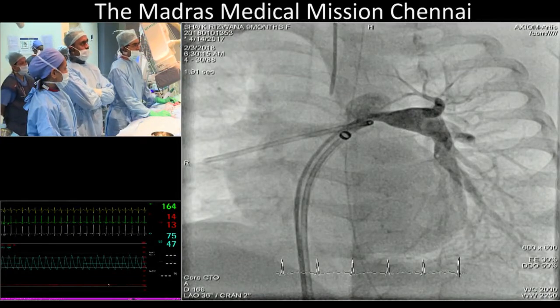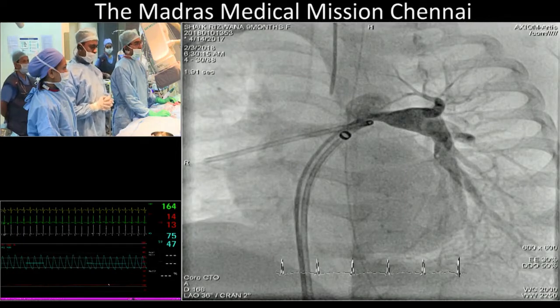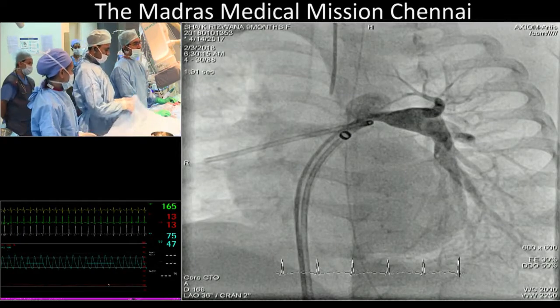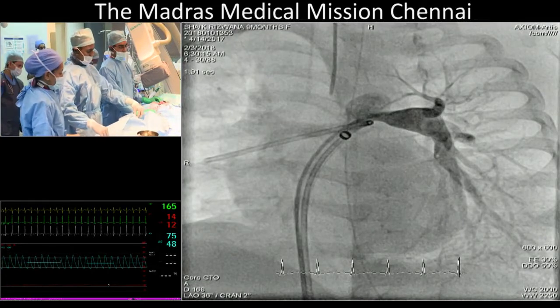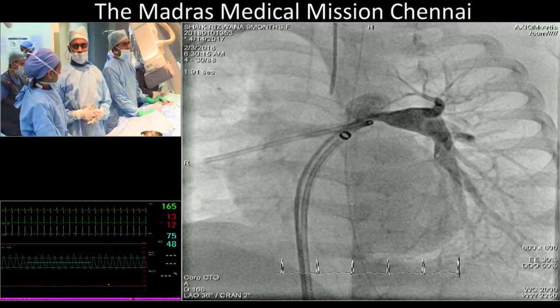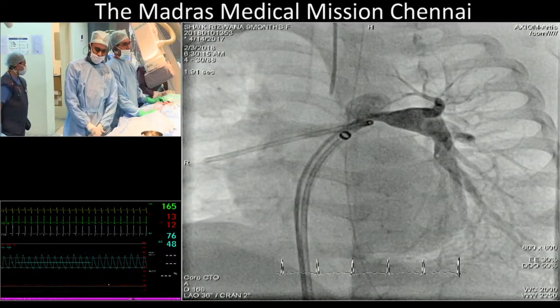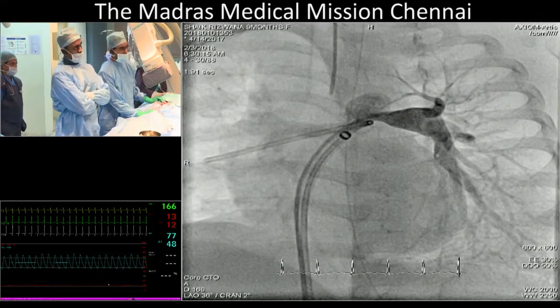Okay, so let me just ask a few people what to do here. So Dietmar, you haven't said anything at all. You've been very quiet. Challenging anatomy, easy thing to deal with? Good morning, Shiva. I love your presentation at 5 o'clock in the morning. Hi, Dietmar. It's a very nice case to present.